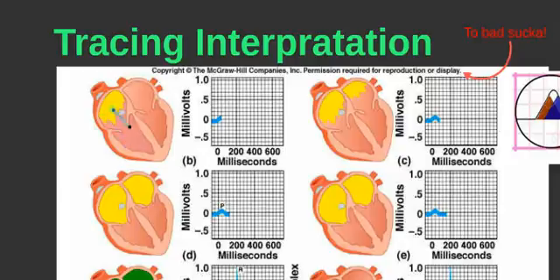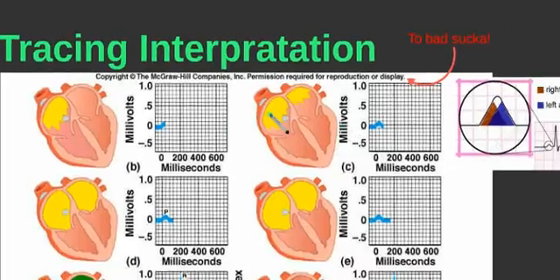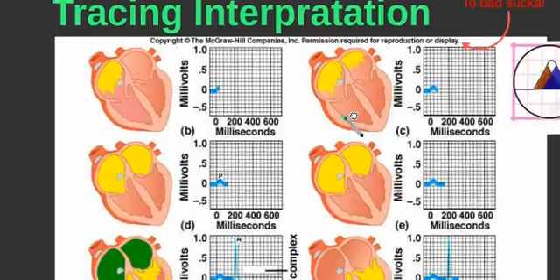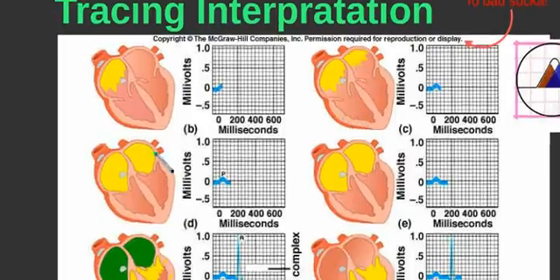We're going to see a diffusion of the depolarization in the atria, and we're going to see us come off this isoelectric line with positivity in voltage. And then we are going to go into the left atrium. And this is something that's really cool that I found out that I did not know, is that the P wave correlates to both sides of the atria, the left and the right. We are now going to go into full depolarization of the atrium, where we see the full P wave. We've come back down to the isoelectric line down here.